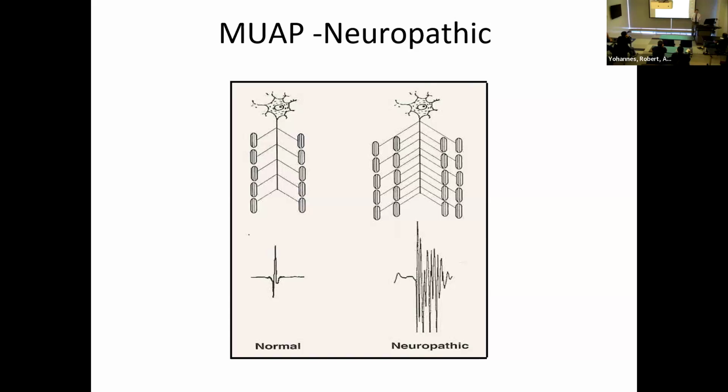Large, right? The other thing is that it's going to be, again, erratic. It's not going to look normal like this one. It's going to be erratic. Now, it's going to be very large in terms of size, in terms of amplitude, but more importantly, width. And what is the reason?